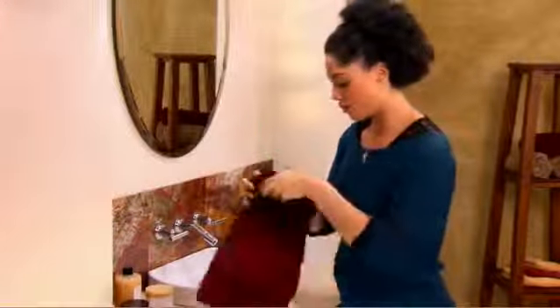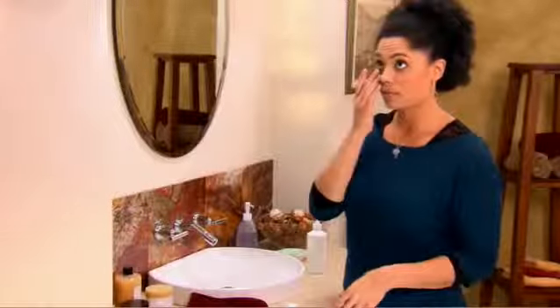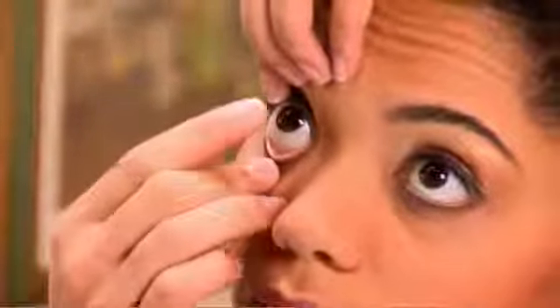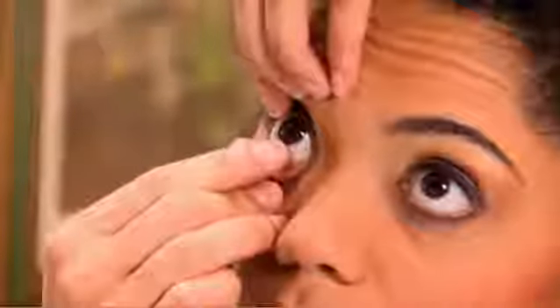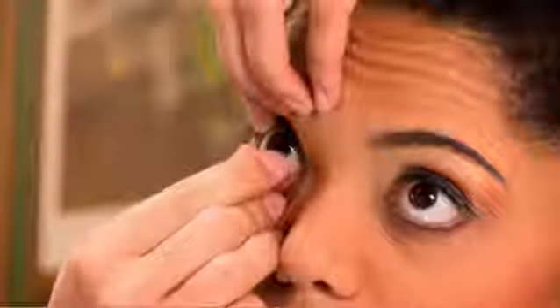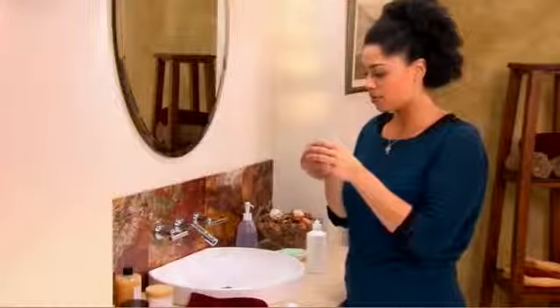Always start with your right eye when removing your lenses. Looking upwards, hold your upper eyelid with the index finger of your left hand. Pull down the bottom eyelid with the middle finger of your right hand. With the index finger of your right hand, slide the lens down to the lower white part of your eye. Now gently squeeze the lens between your right thumb and index finger and remove the lens from your eye without any excessive folding.